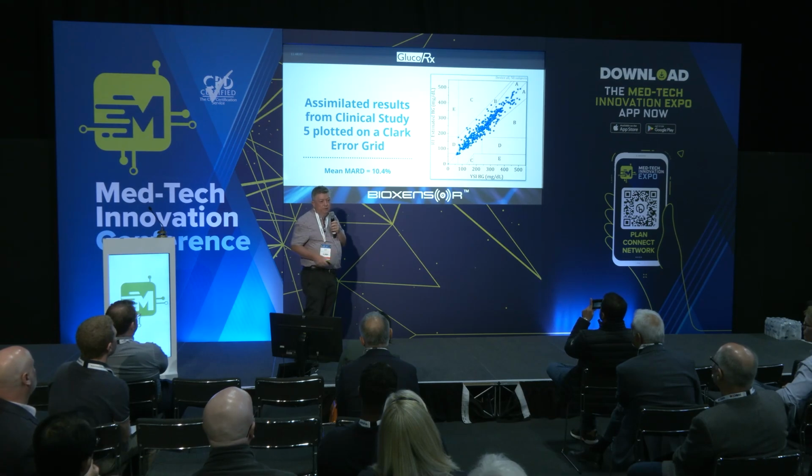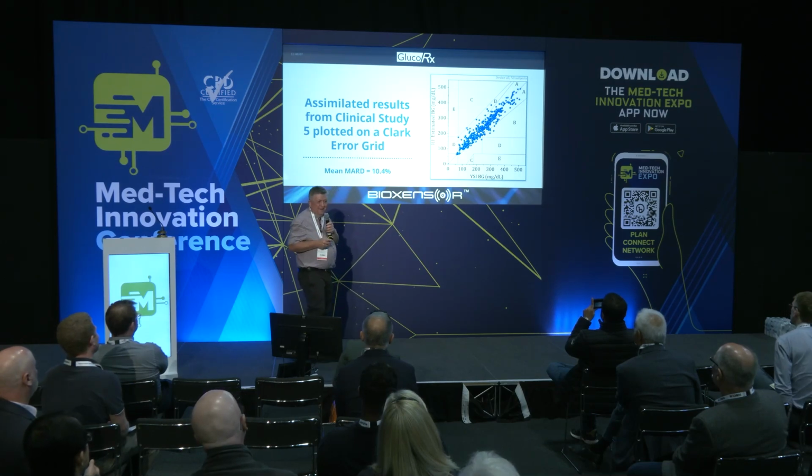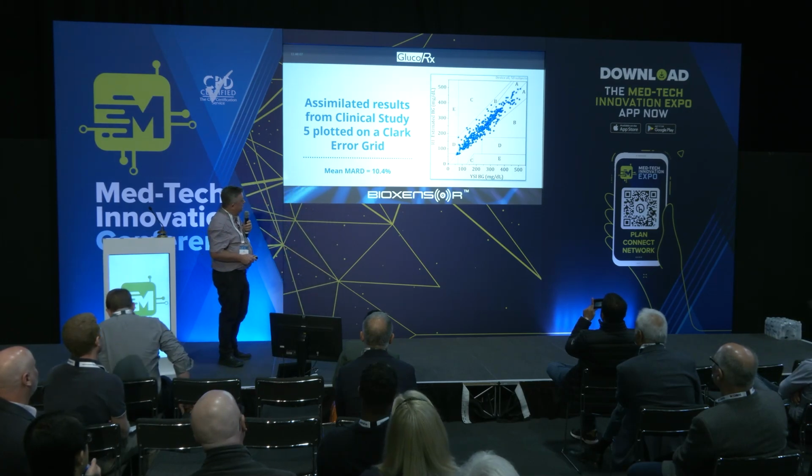We can tell if they popped out for a cigarette and things like that, in terms of things like temperature difference, nonetheless. And they do this without telling us, of course, but we know. We can tell from the data. It's a pretty good motion sensor, this, as well.